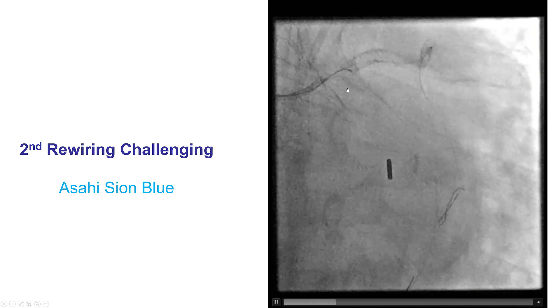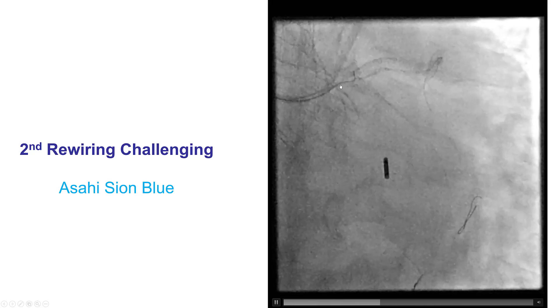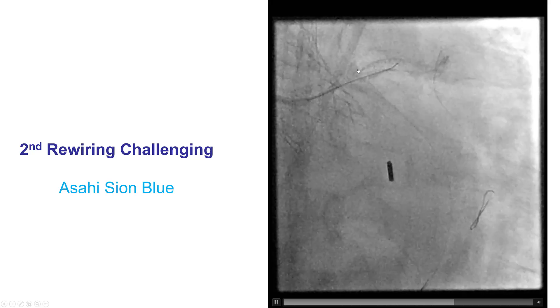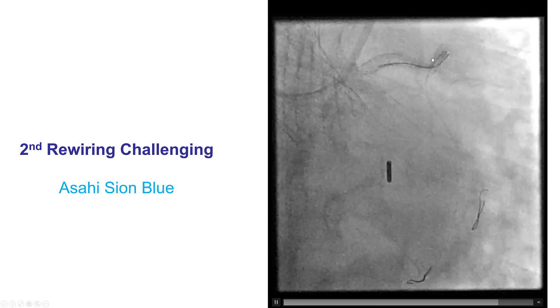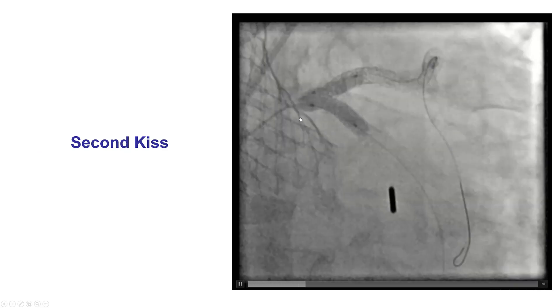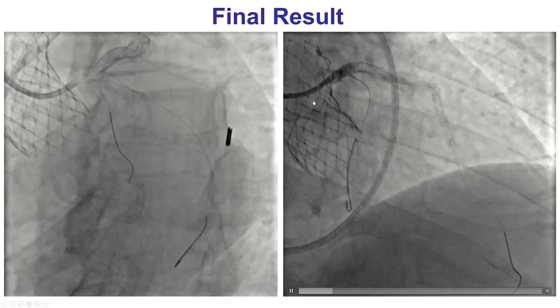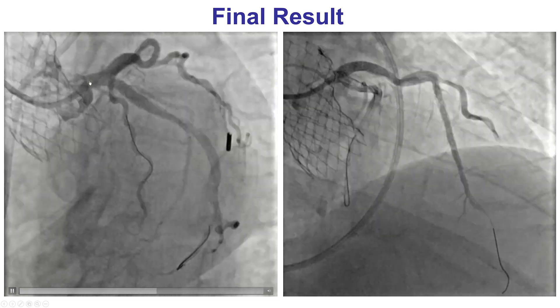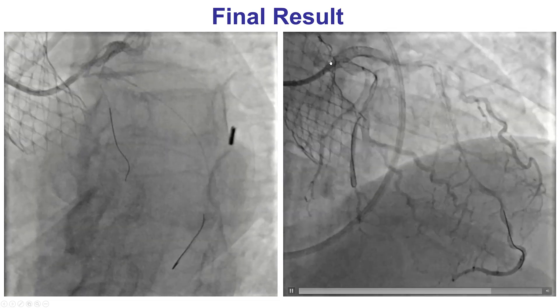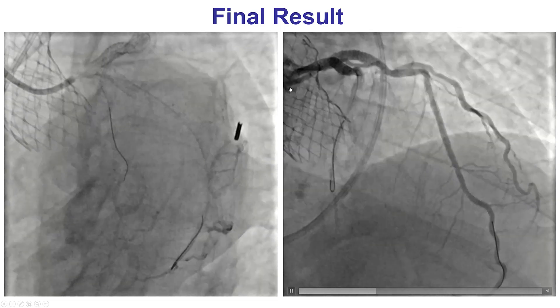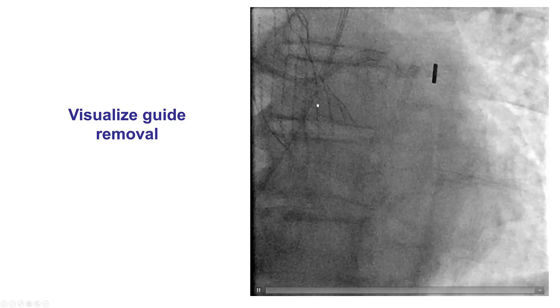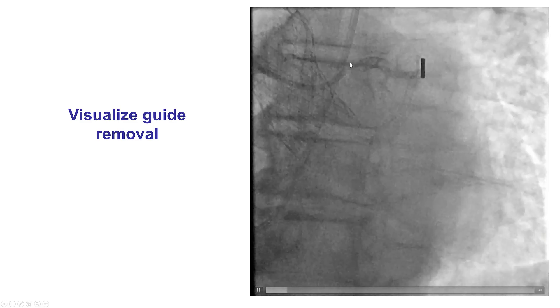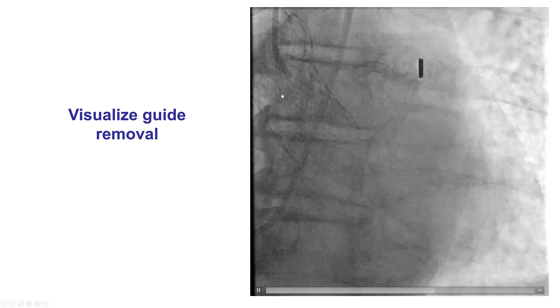We did have some difficulty rewiring into the LAD. This is the second rewiring, so we want to go from a distal strut. Eventually, after some attempts, we were able to advance a Workhorse Blue wire into the LAD. We performed the second kissing balloon inflation with good expansion of the balloons and a nice final result, both angiographically and by intravascular ultrasound. We had to remove the guide extension used earlier in order to perform kissing balloon inflations, since we could not fit two balloons through a 6 French guide catheter extension. A nice result was achieved, and then we removed the guide catheter under fluoroscopy to make sure we did not have any issues with entrapment.